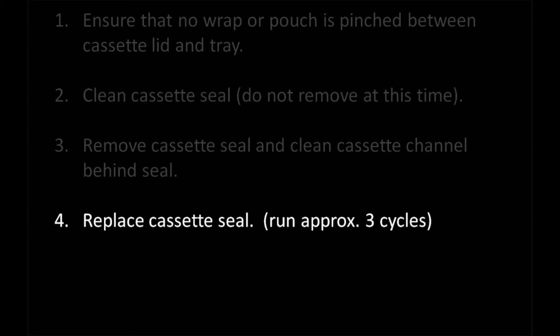Once you have cleaned out the cassette channel, replace the cassette seal with a new one. Steam may still leak out after replacing the seal, so run the Statum for a couple of cycles to allow the seal to seat up properly.